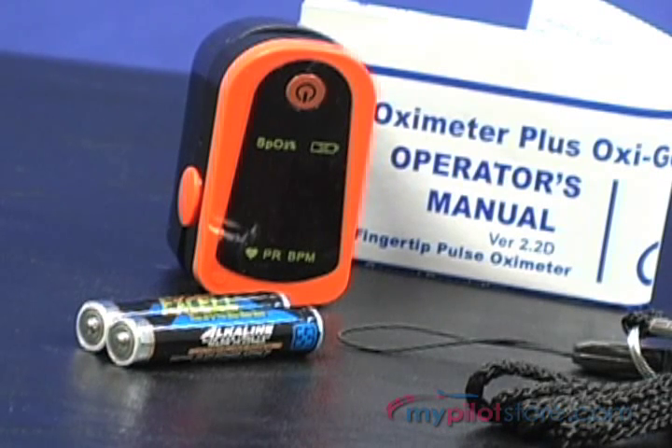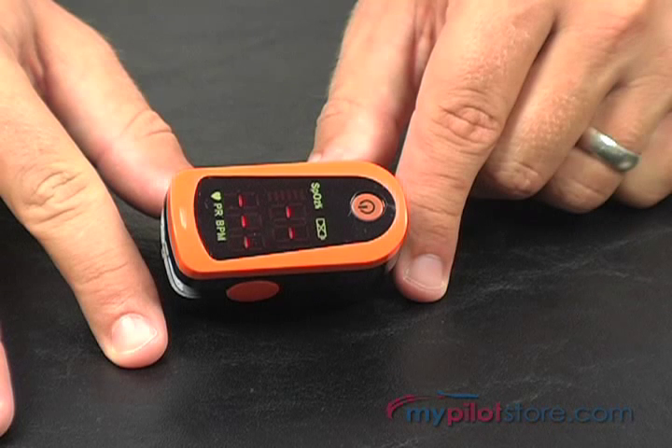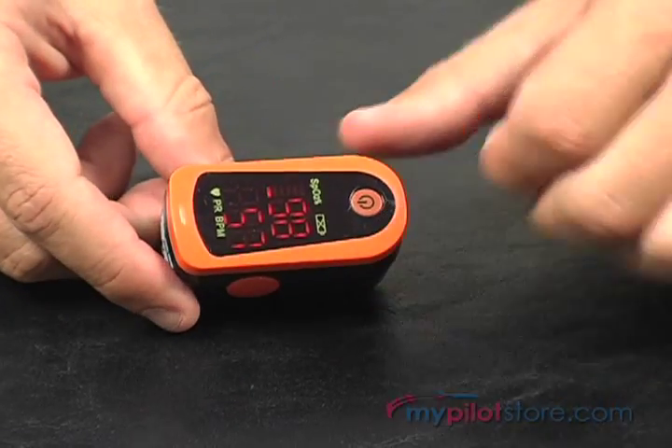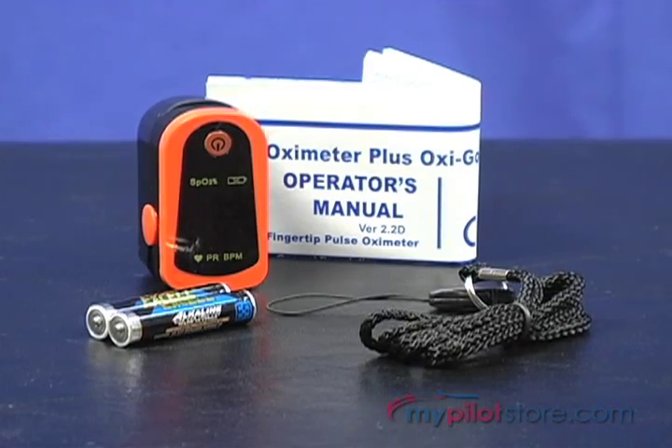It is powered by two AAA batteries which last for about 30 hours of operation. It has an auto shutoff power saving feature after no signal is detected for 8 seconds. The LCD display also indicates when the batteries are low and should be replaced.